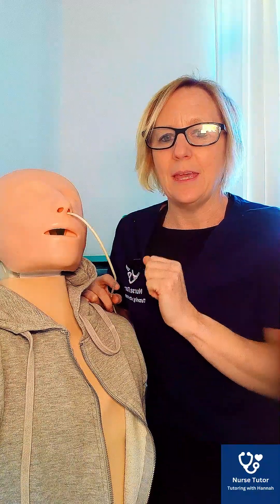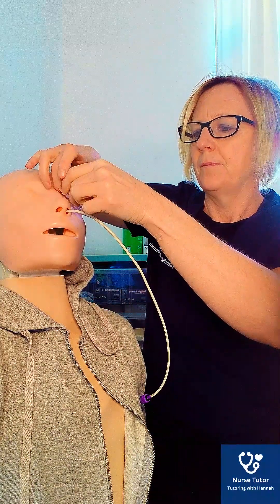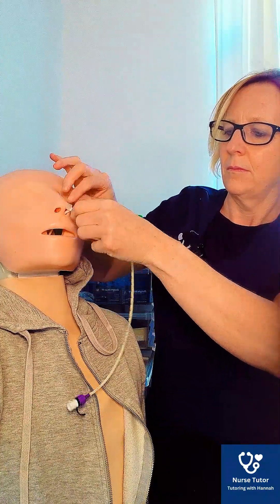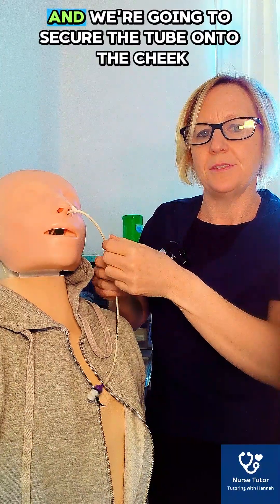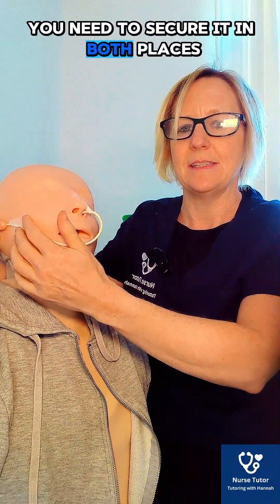Once we've advanced the tube to our measured position, we're going to secure the tube on the nose and also onto the cheek. In your NMC exam, you need to secure it in both places.